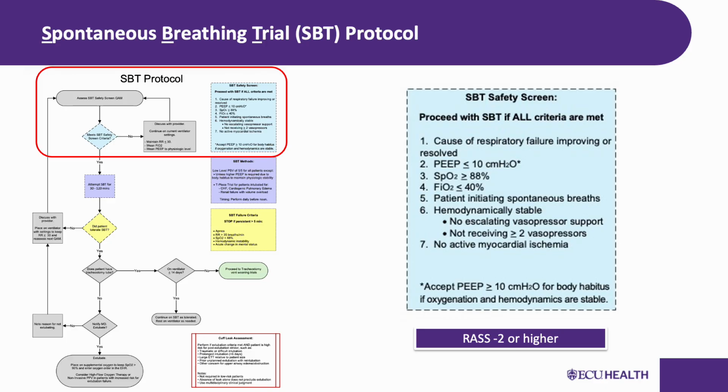All patients on mechanical ventilation will be assessed for SBT safety screen every single morning, with the exception of our chronic home vented patients. This is not optional. It is not whenever you get around to it, it is every morning. If night shift is unable to do it before we change shift report, then day shift completes it. We are one continuum offering respiratory care services. This is one of the most impactful things we can do to reduce ventilator days because it ensures no patient slips through the cracks.